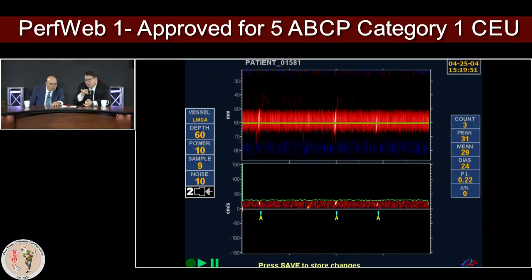So you see the speed higher up closer to the green line. That's a lighter material. The third A is sitting in the middle of the blood flow, so definitely it's a real bigger piece because it's traveling slower.